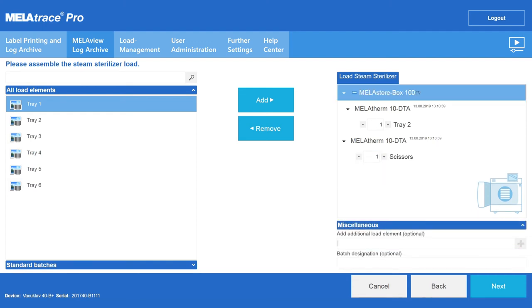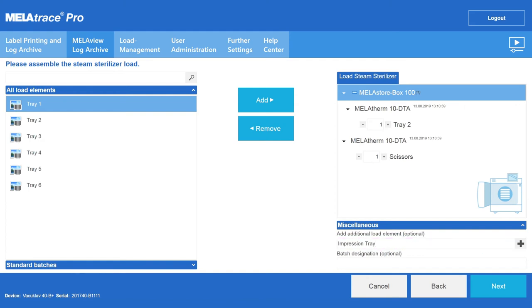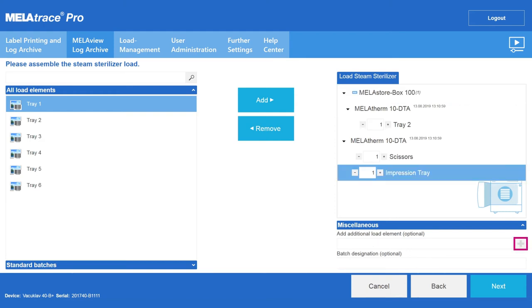You can enter the name of the new instrument and then add it to the steam sterilizer load by clicking on the plus symbol. Confirm your load configuration with Next.